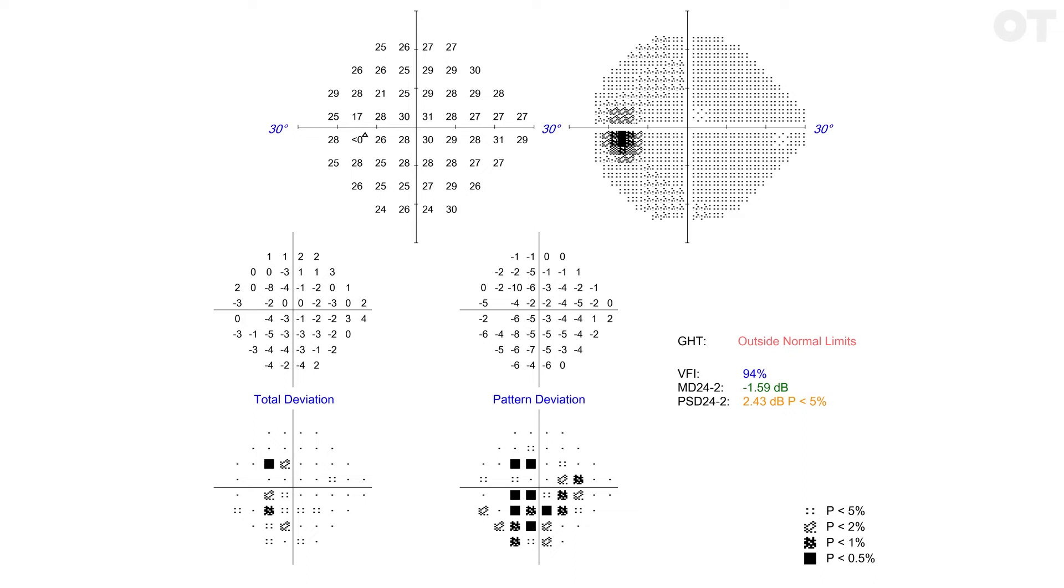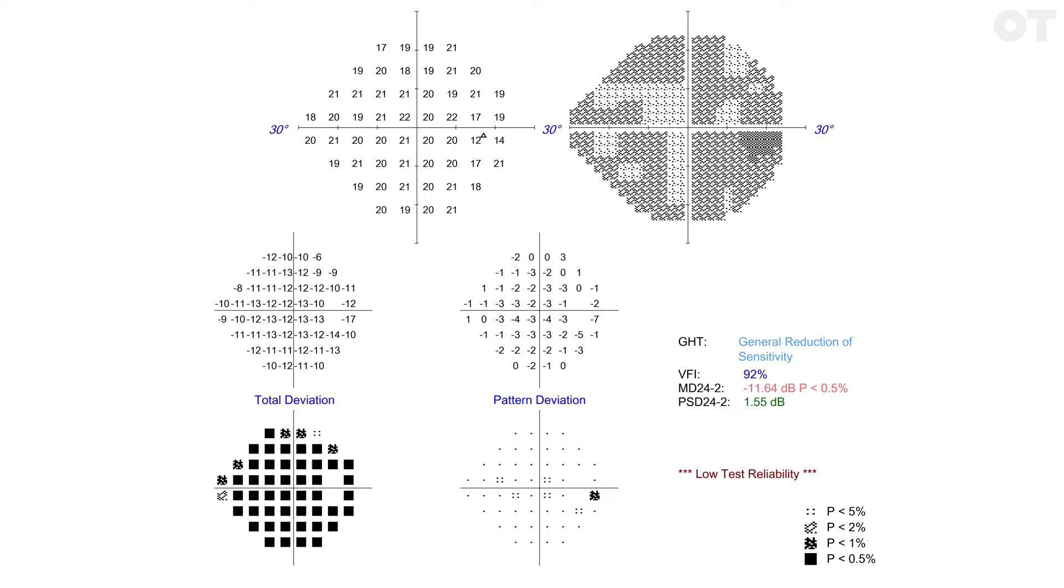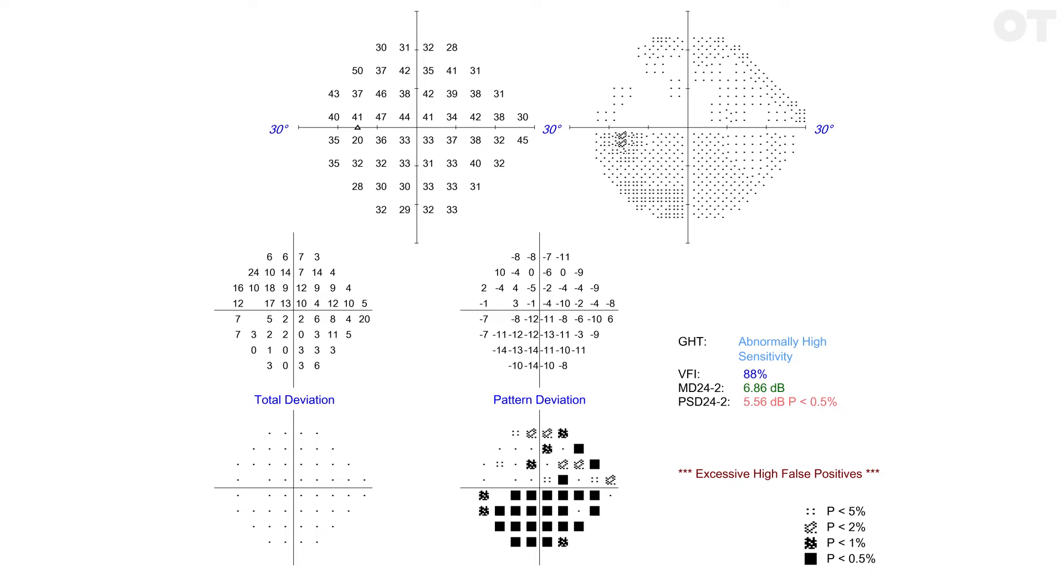The total deviation and pattern deviation should be compared - do they look the same or are they different? If there are lots of general points shown on the total deviation map, but none on the pattern deviation map, there is probably cataract. If there are lots of points on the pattern deviation, but not on the total deviation, the patient was probably trigger happy. Confirm this by looking again at the false positives.